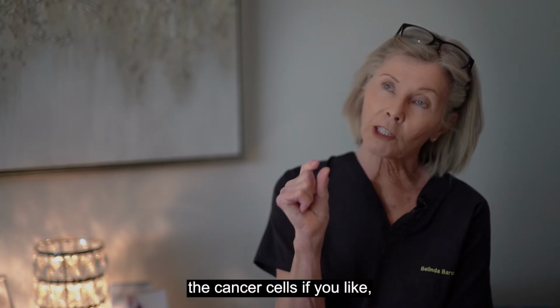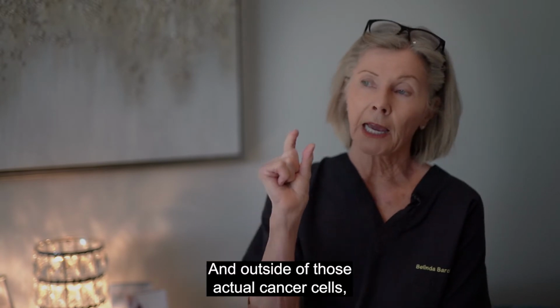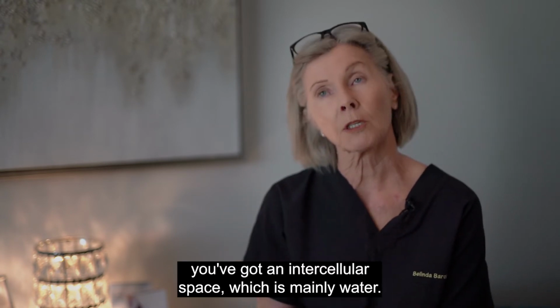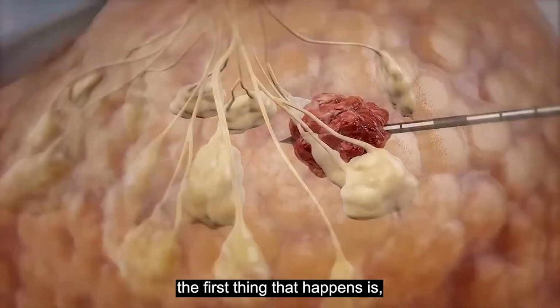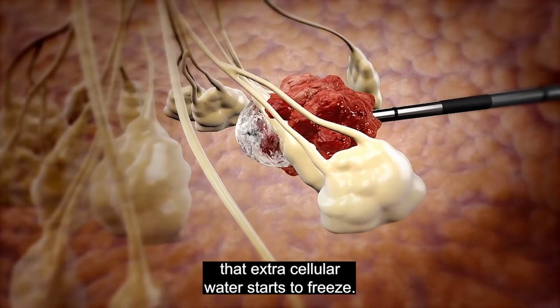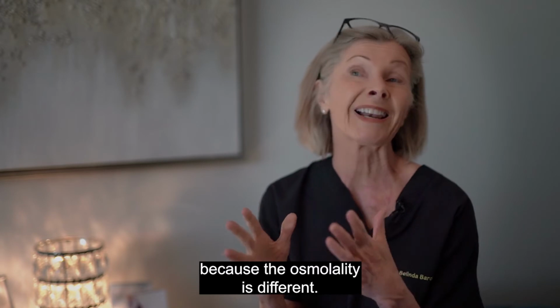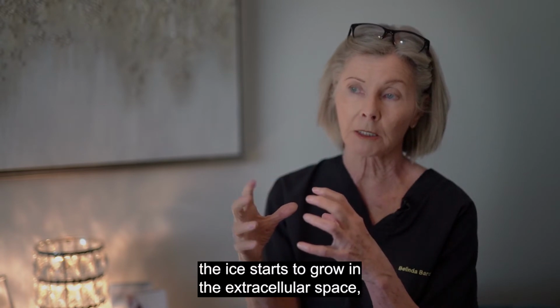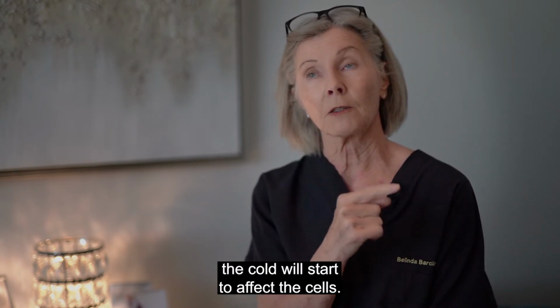So tumors are made up of the tumor cells, the cancer cells, if you like, and so a cancer has a volume, right? And outside of those actual cancer cells with the cancer DNA, you've got an intercellular space, which is mainly water. So when we insert the probe, and as you grow the ice ball, the first thing that happens is that extracellular water starts to freeze. And it freezes first before the internal part of the cell freezes, because the osmolality is different. So the ice starts to grow in the extracellular space, and you get crystals and all the rest of it. And then eventually the cold will start to affect the cells.